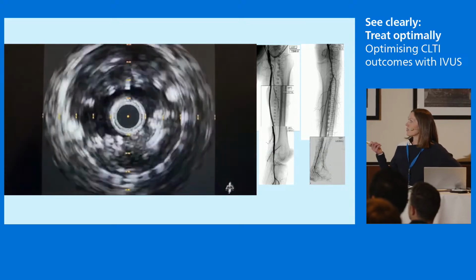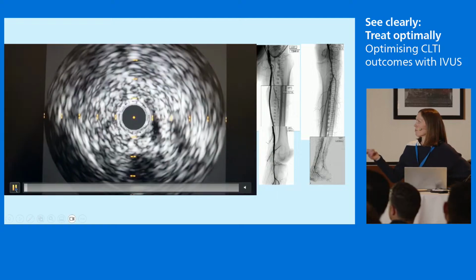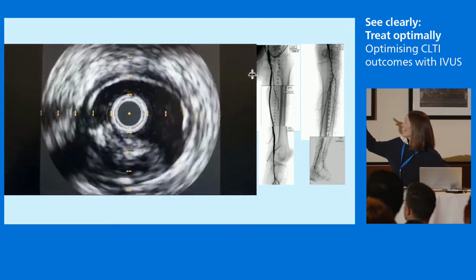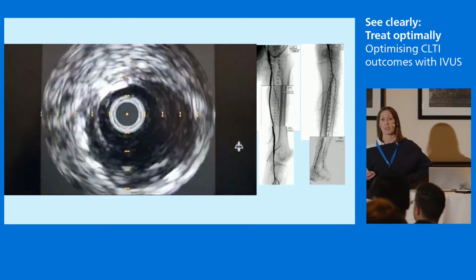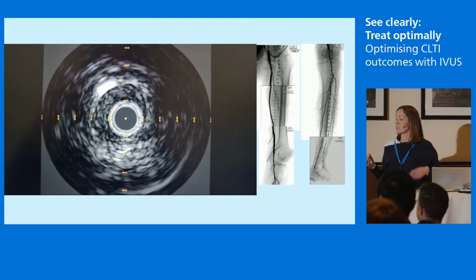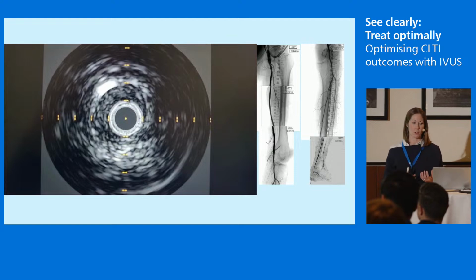If you look at the bottom end of that stent, I'll play it through again. There is some resistant disease in this below-knee segment, but it comes out as less than 50%, and so we could have the confidence to leave that, knowing that it was flowing well, it was non-flow limiting. And so defining that treatment zone, I think you do get a lot more subtlety than just looking at an angio and trying to say, well, is that flowing well or not?